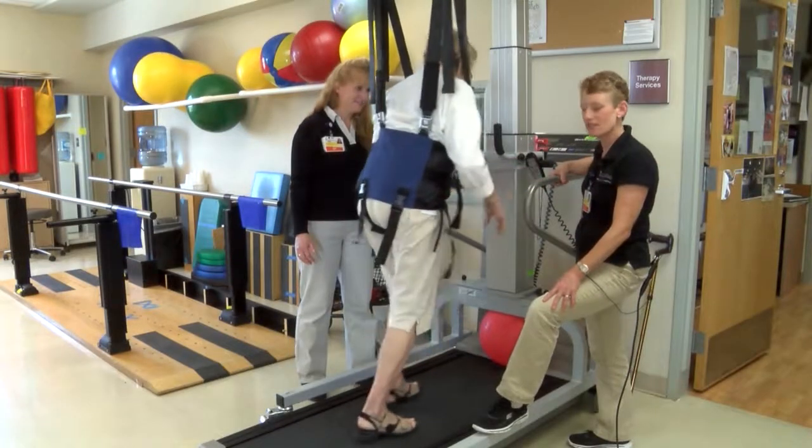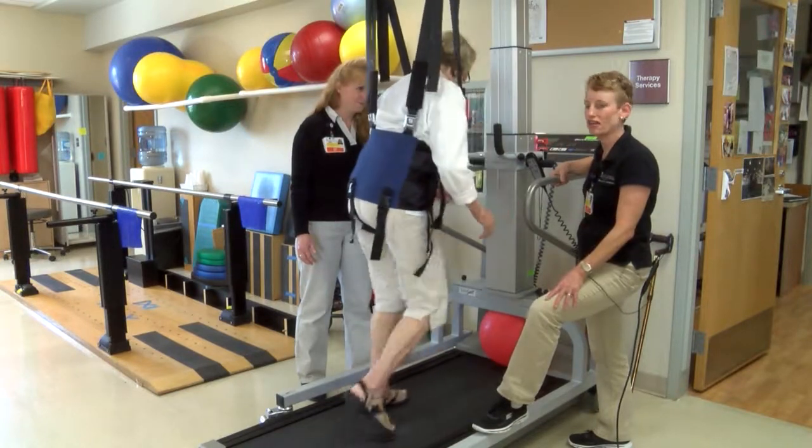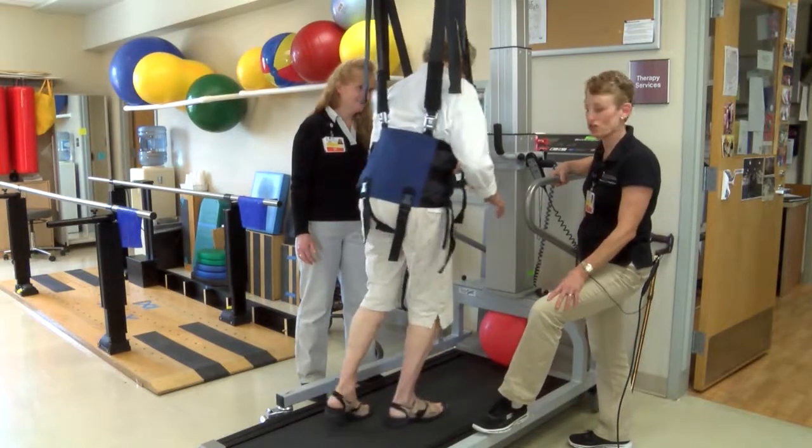It takes a lot of practice, but the good news is she doesn't have to worry about falling and she's completely safe while she's working on this.